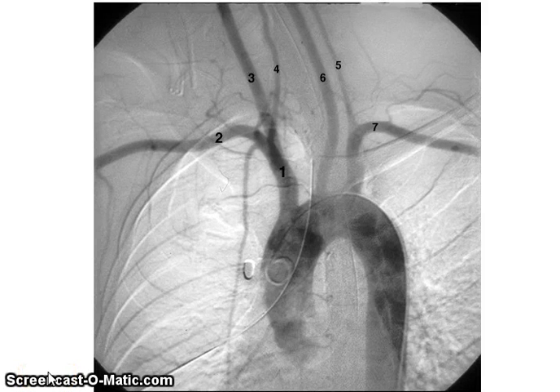This week we're talking about the neurologic system, so basically imaging that deals with the brain and spinal cord. So we'll start with an aortic arch arteriogram, and that is typically done in the LAO position. That's the best position to see the three major branches off the aortic arch. You'll want to center approximately at the jugular notch.